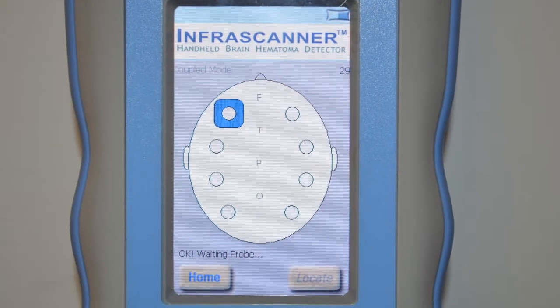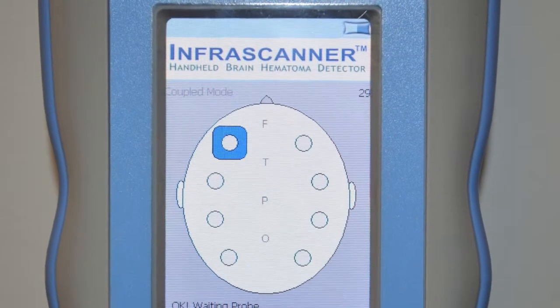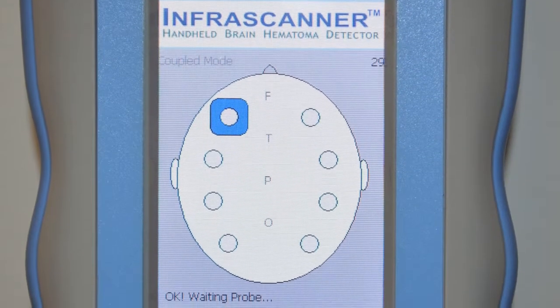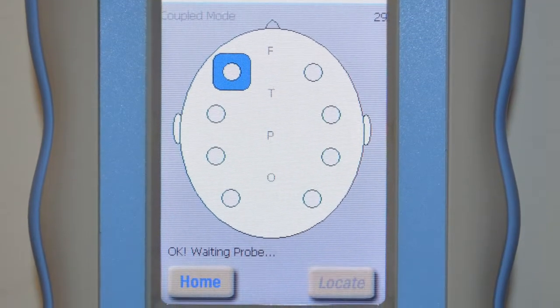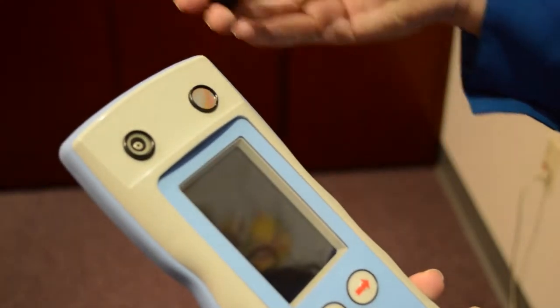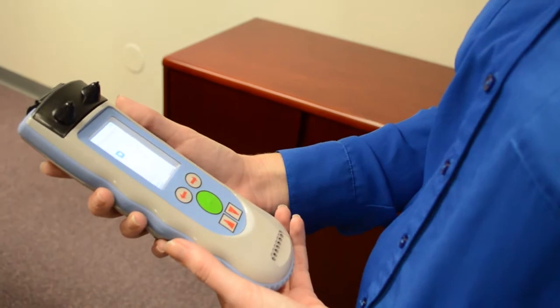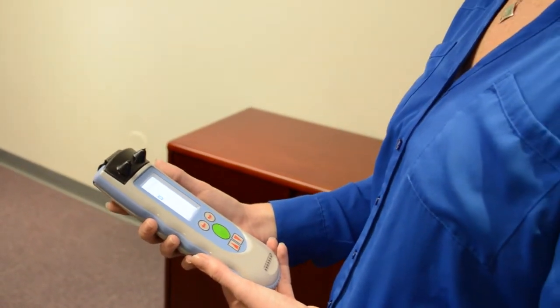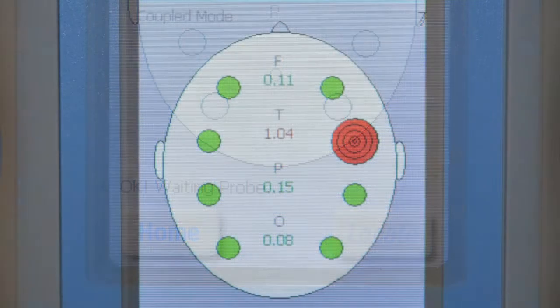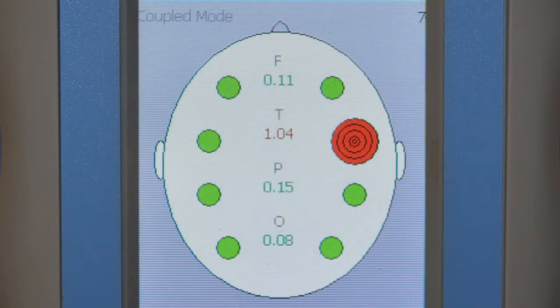The measurement screen shows the top of the head with ears and nose helping indicate left/right pattern sequence. The battery indicator is on the top right. Under the InfraScanner logo is the measurement number. Look for 'coupled mode' and 'OK waiting probe' telling you the InfraScanner is ready to scan. If you see a communications error, take off the fiber optic shield and put it back on to restart. The locate selection in the bottom right is for field or remote use — if a hematoma is detected, it enables extra measurements to pinpoint its location and allow for emergency procedures.